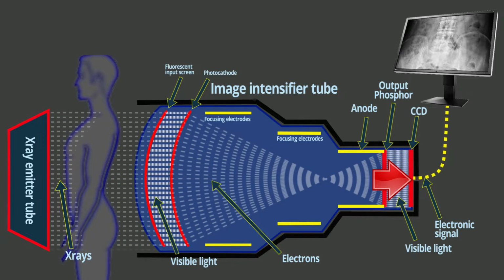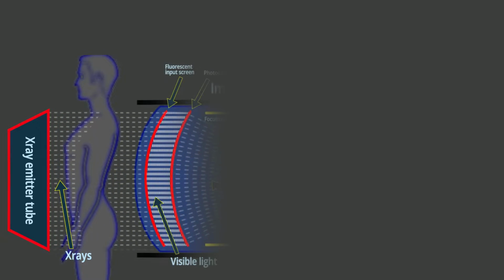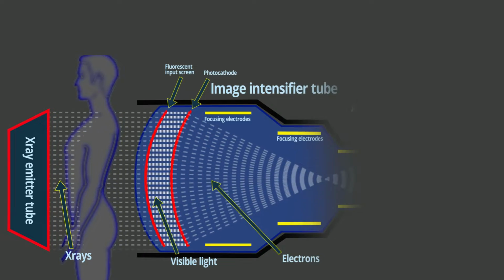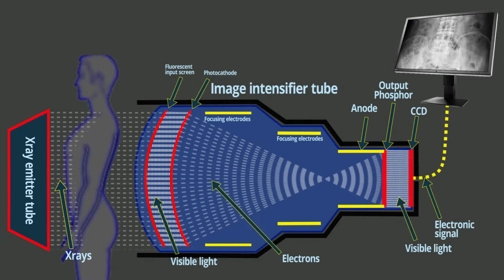During the transmission of the incident X-ray photon to the various layers within the image intensifying tube, the energy output is being increased through conversion of the energy into electrons and light photons, to ensure the maximum amount of information reaches the CCD and the final image being viewed on the monitor during fluoroscopic screening. Now we will focus on how these components relate to various equations.